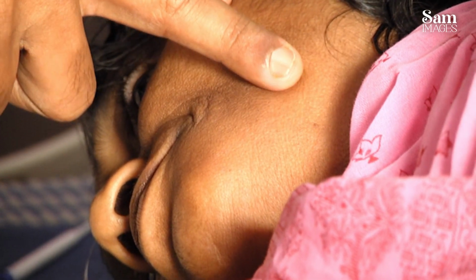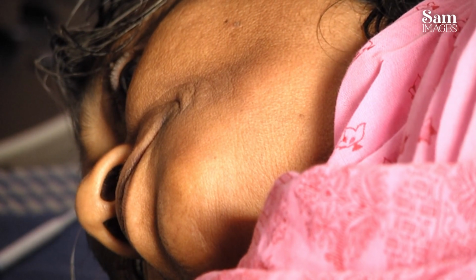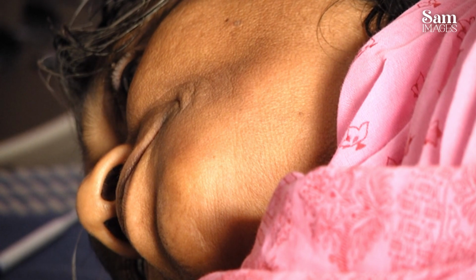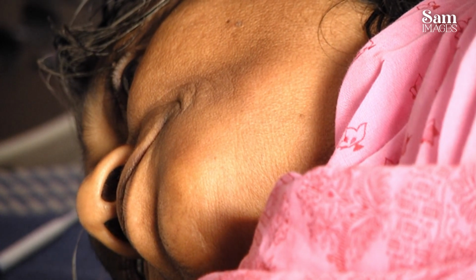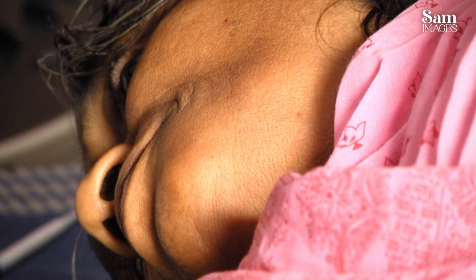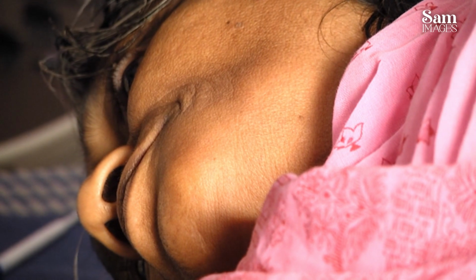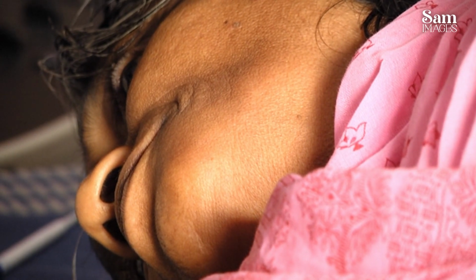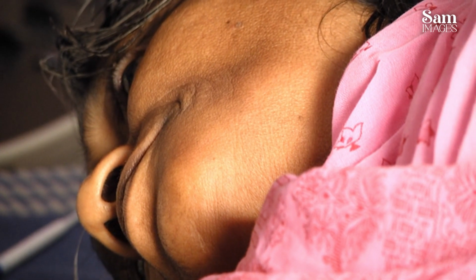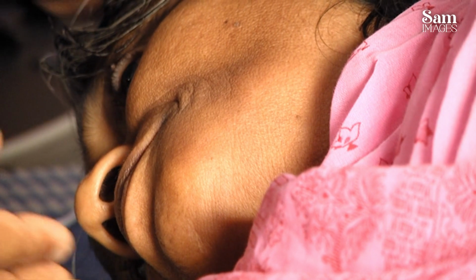Okay. What I will do is, before you examine the abnormal pathology, always do it on the normal side first, so you'll have a clinical orientation. If you want, you can do a split screen of both sides. One side will be normal, the other side will be abnormal. So when you begin doing it, you will appreciate the normal anatomy on one side and the abnormal anatomy on the other, so whether pathology is there or not, you can appreciate it better.